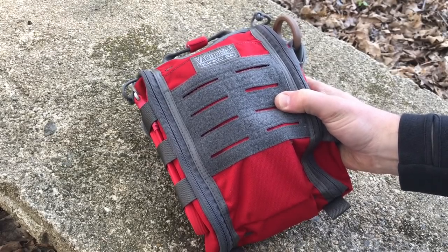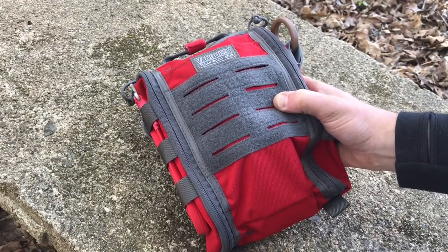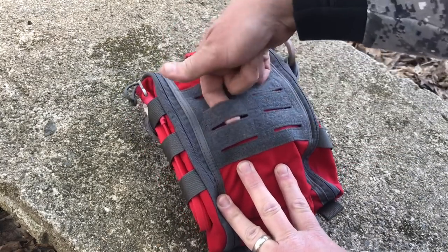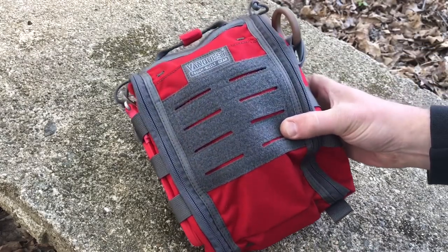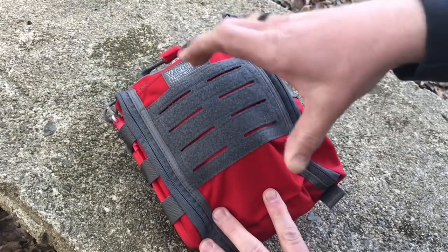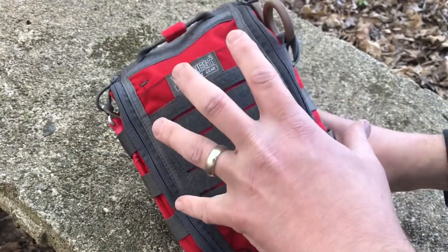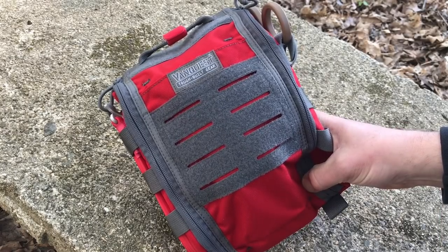First off, the material is 1000D Cordura with YKK zippers. Like all their other gear it's going to be really nicely made. You've got hook and loop here as well as you can run anything that can attach to MOLLE webbing across the front. You can put your blood type patch there, or attach another pouch on the front with their MOLLE sticks if you want. So you can make this with another layer on top. Again, just high grade material, nicely made.